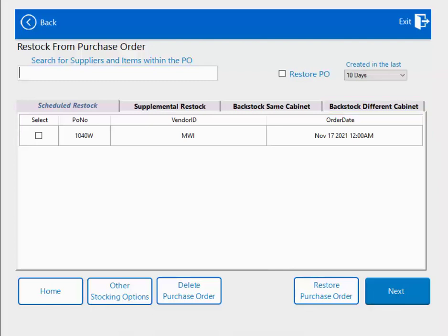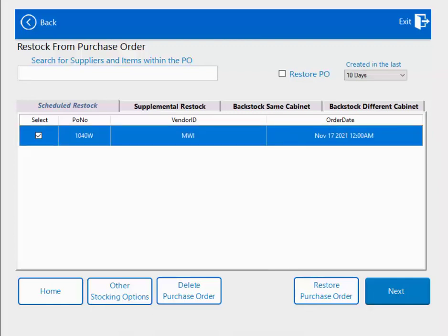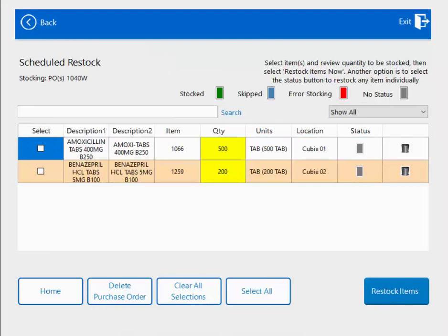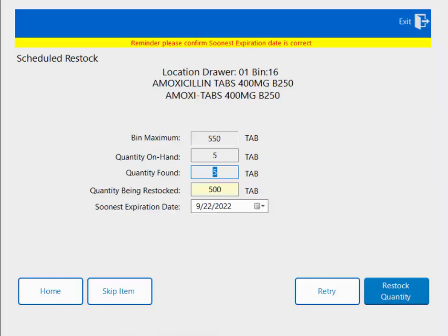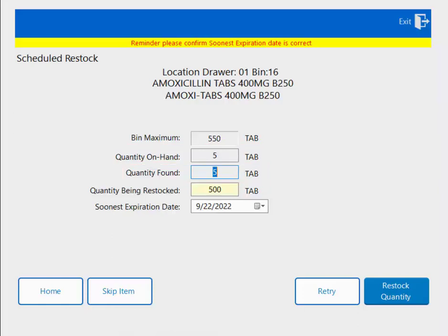Let's get started with a scheduled restock. I have a supplier purchase order that generated and now needs to be restocked. I will select the purchase order, click next, and I'll be brought to the purchase order screen, which will show me what items need to be restocked. I'm going to select both items and hit restock. Qubex will take me through each item one by one. It shows me the max for this bin and my current quantity on hand. I have the opportunity to do a cycle count and change the on-hand quantity if it differs from what Qubex shows.